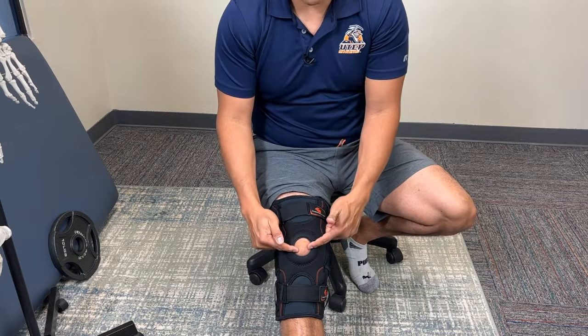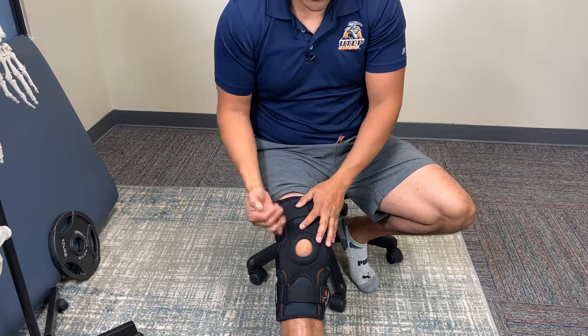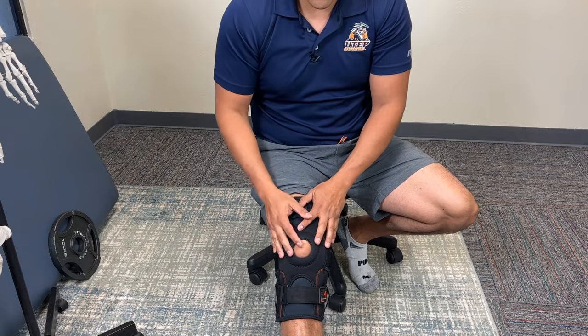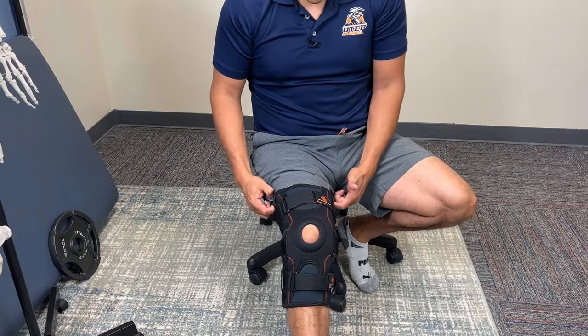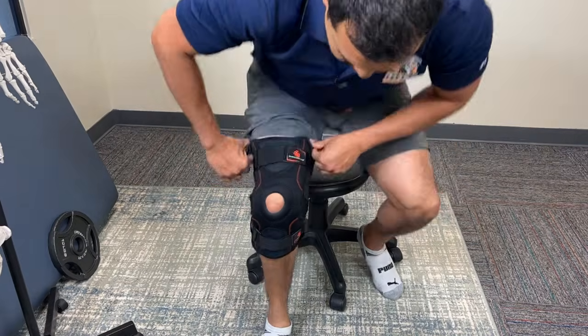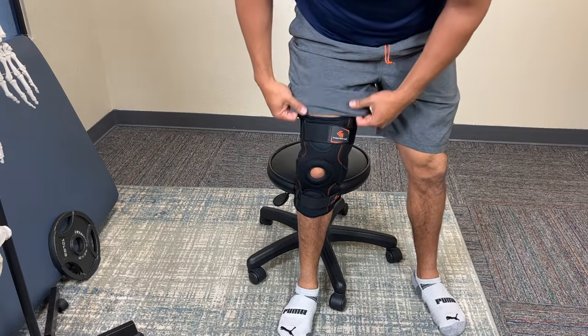It's okay if it's not perfect. You just want to start with your kneecap in the hole, but once you get to moving around, it's going to shift from positions here. And you're going to find that it slides down as time goes on, so you have these little hooks here to pull it back up whenever you need to. So as you walk around doing things, you can always just cinch it back up.